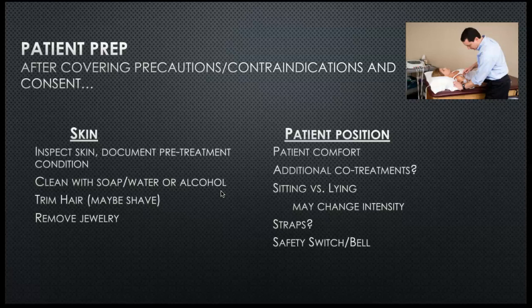However, Dr. Barrett will tell you, because she's an expert on skin and a wound care specialist, that cleaning the skin with alcohol actually strips your skin of some natural protective things. It can actually cause skin irritation. So in an ideal world, you would clean your patient's skin with soap and water, or even just water, before you stuck the electrode on them. Most of the time it's not a problem. You can use an alcohol wipe, but ideally you'd be able to do it with soap and water.